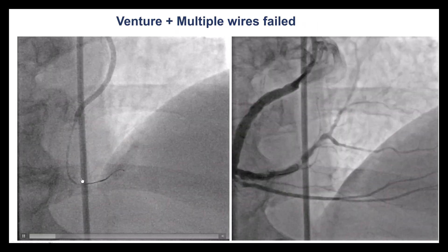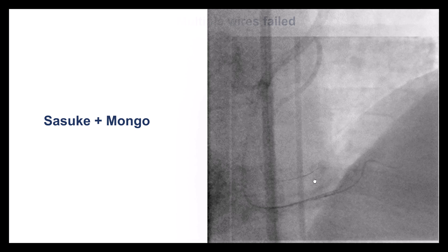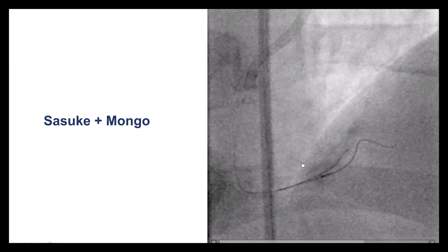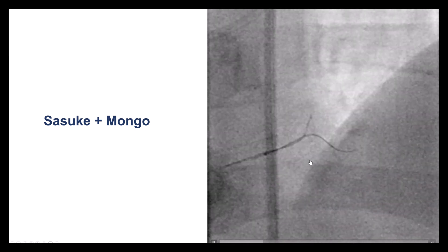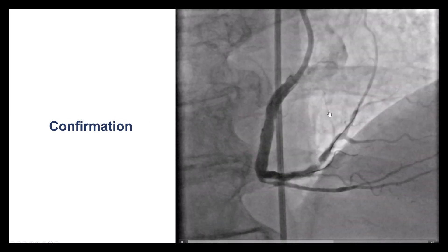We tried the microcatheter and several guide wires, but again had a lot of difficulty getting through the distal RCA lesion. Eventually, we switched to a dual-lumen microcatheter positioned at a side branch close to the lesion. After multiple attempts using a Gladius Mongo wire — a polymer-jacketed stiffer-tip guide wire — the wire eventually went into the posterior lateral. This was confirmed; the wire is indeed through the lesion and in the PL.